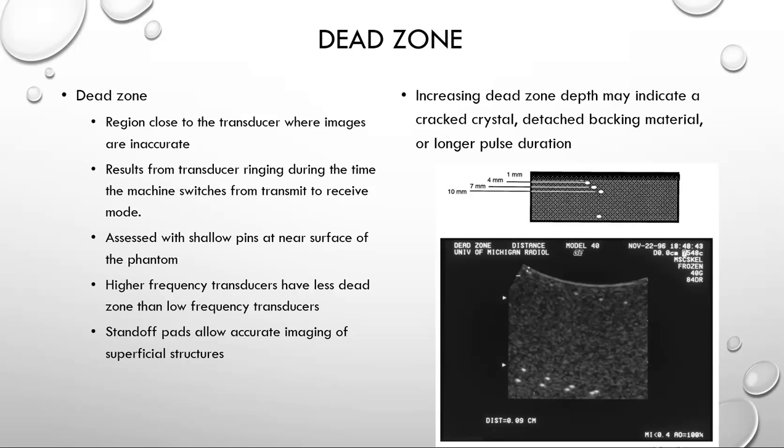An increasing dead zone depth may indicate a cracked crystal, detached backing material, or longer pulse duration, all things to be evaluated.